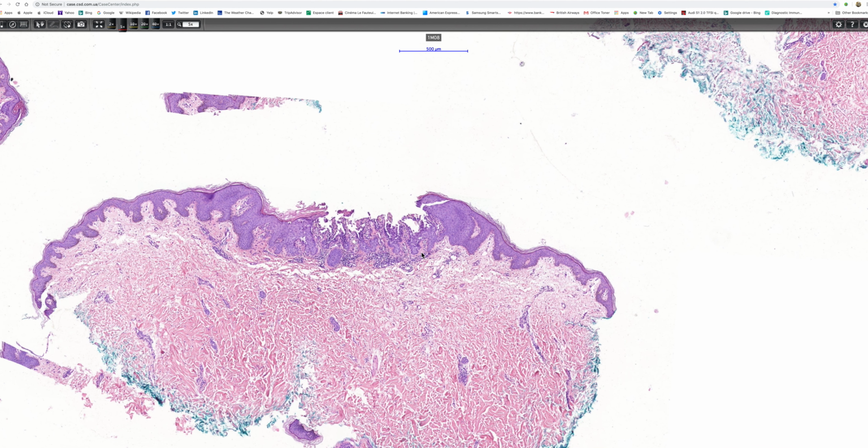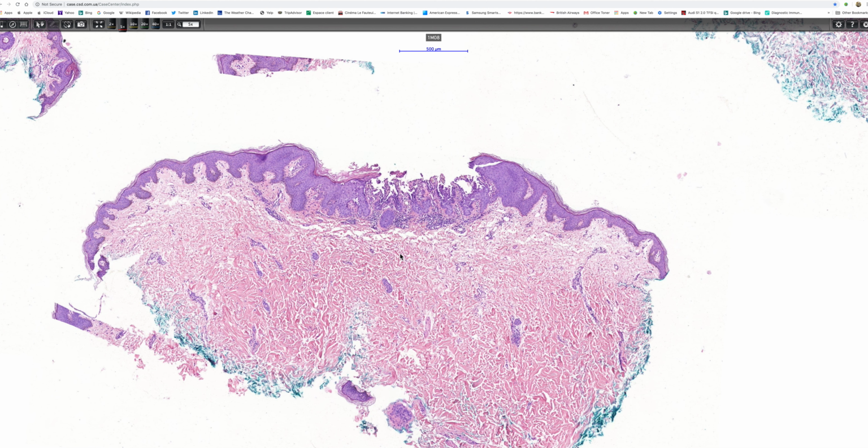Now, this is a solitary lesion, and so I suppose the two differentials that are most reasonable are warty dyskeratoma versus an acantholytic acanthoma. Now, a warty dyskeratoma arises within the wall of a cystic hair follicle. And in this lesion, I don't see any evidence of any follicular structure.